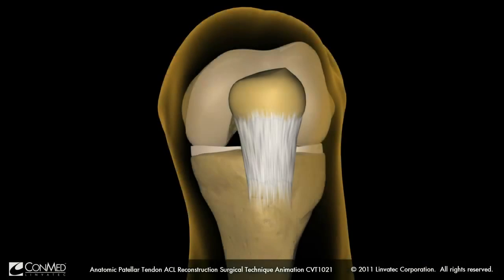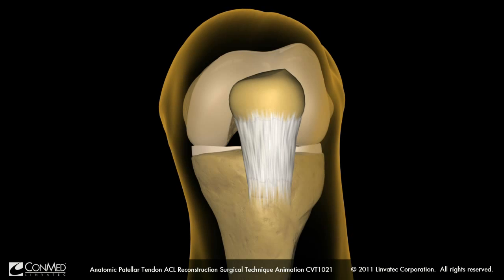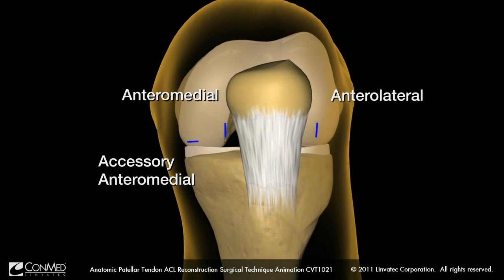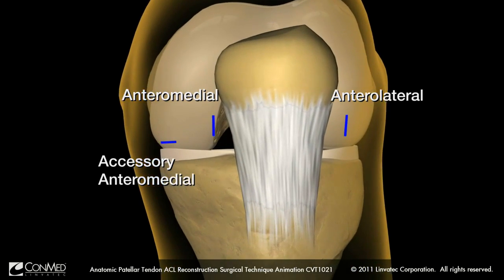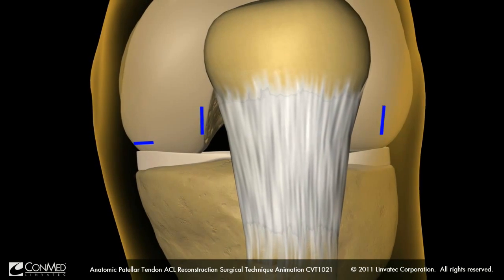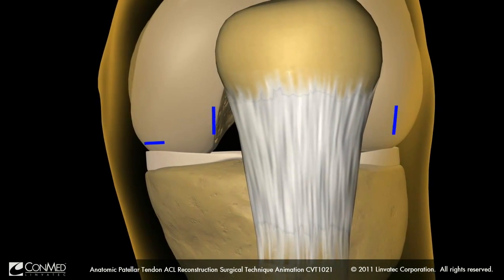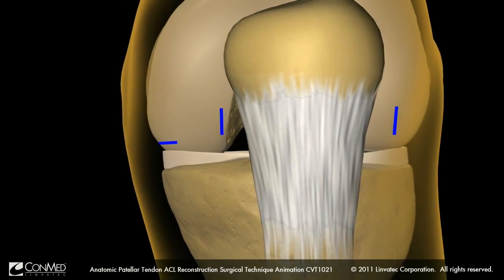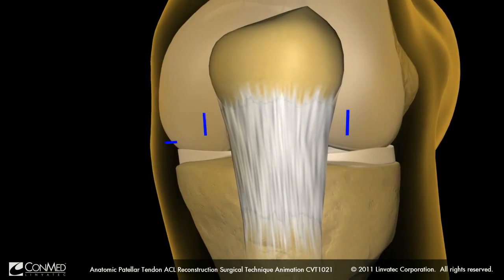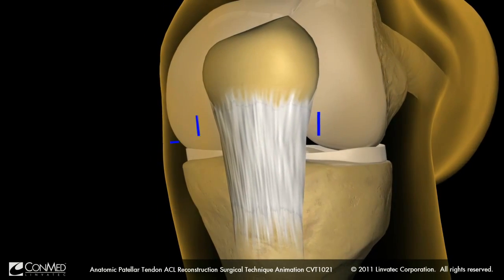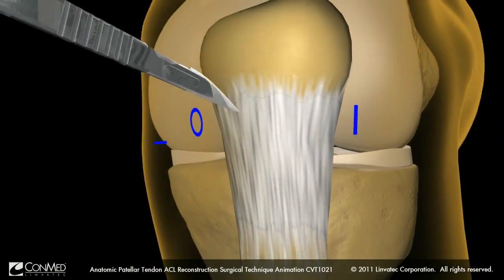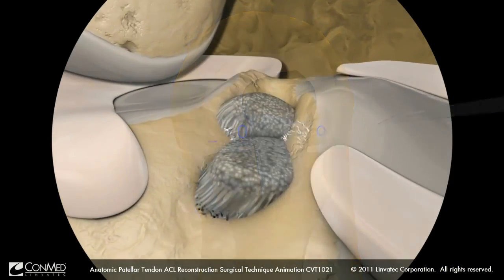Arthroscopic surgical approach for anatomic ACL reconstruction requires three portals: an anterolateral, an anteromedial, and an accessory anteromedial. The standard anteromedial portal will be used for arthroscopic visualization and should be placed close to the patellar tendon and adjacent to the inferior pole of the patella. The accessory anteromedial portal will be used for drilling and should be lower and more medial than the anteromedial portal. With the surgical markings in place, incise the anteromedial and anterolateral portals.